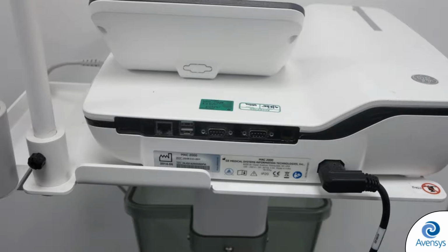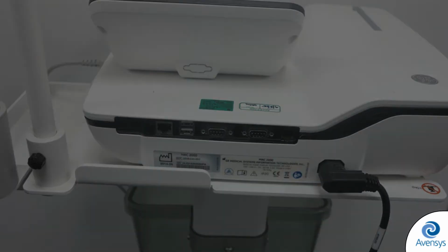On the rear of the unit you will find the data transfer connections, an SD card slot, an Ethernet LAN connection, two USB ports that can be used for an optical barcode reader and Wi-Fi, two communication ports for data connectivity to CS or Muse systems, and a phone jack for an analog phone line that connects to an internal modem. The power connector at the back of the unit should be plugged in whenever possible to keep the internal battery fully charged.